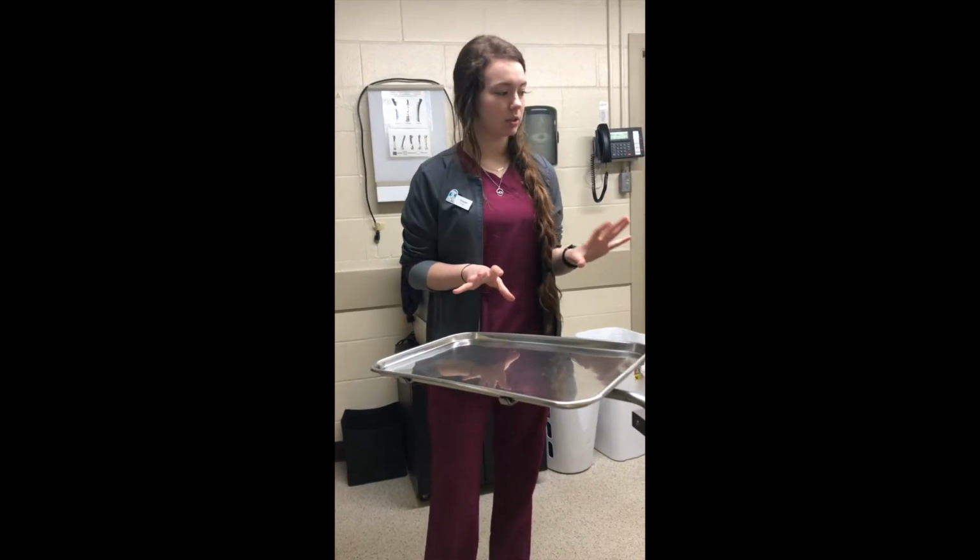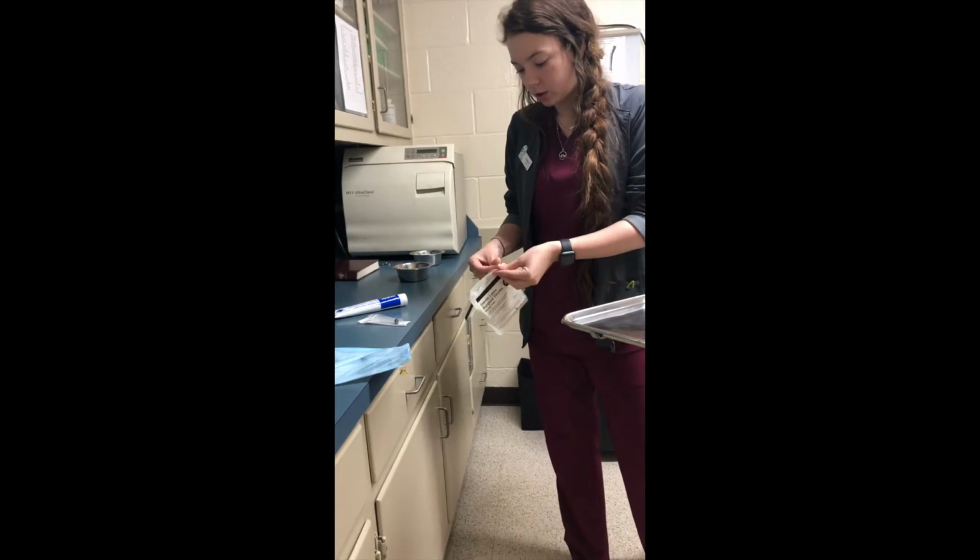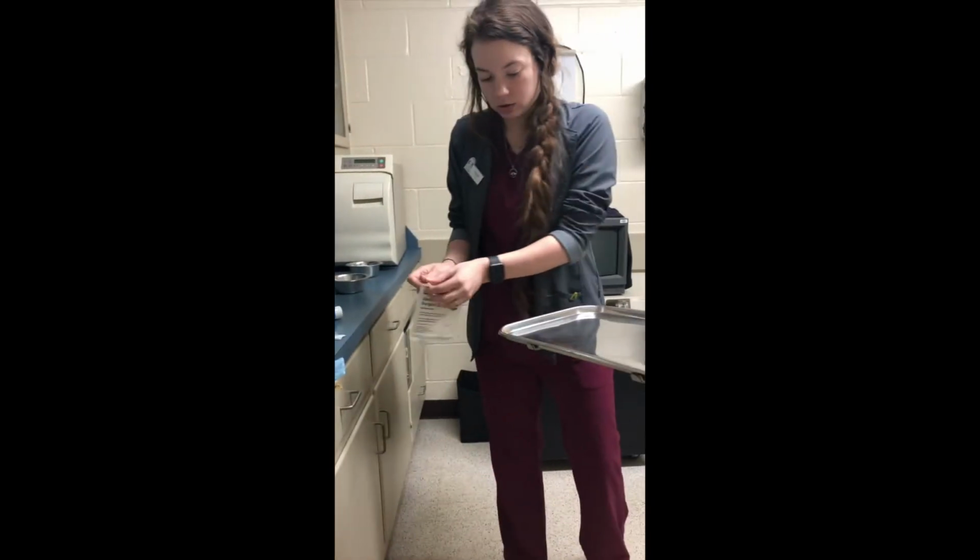Okay, I'm going to get stuff ready to place a urinary catheter to get urine sterilely. I'm going to start by putting out my sterile gloves and creating a sterile field.